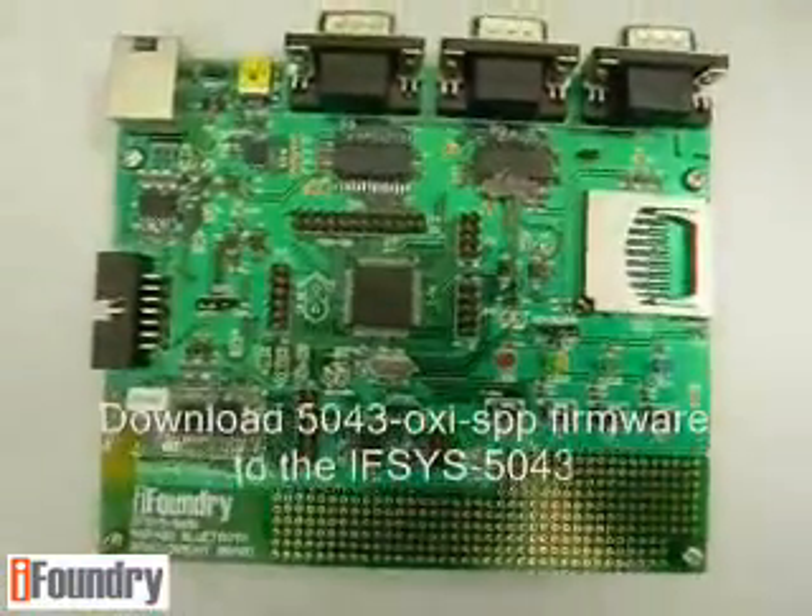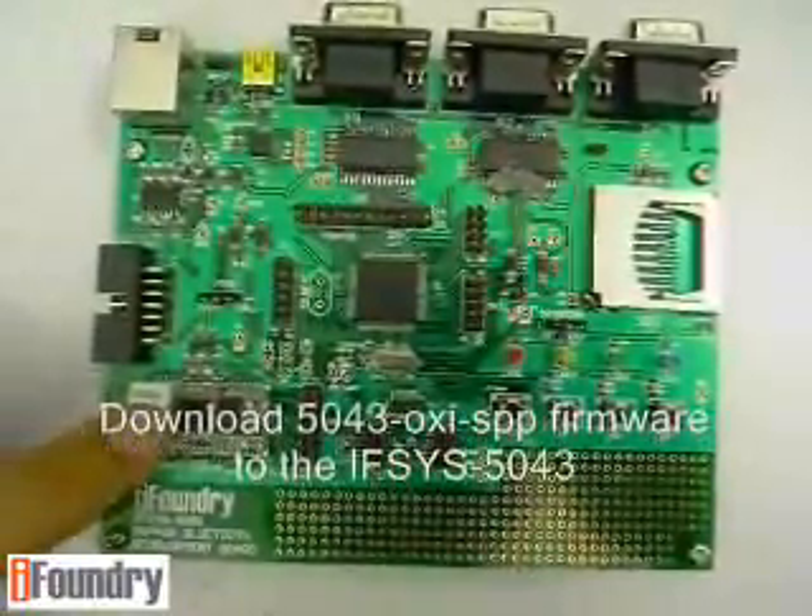And lastly, you need to download the 5043 oxi-spp firmware into the Bluetooth module.